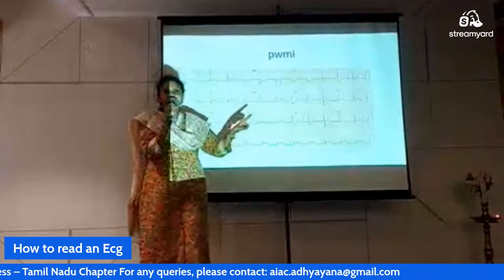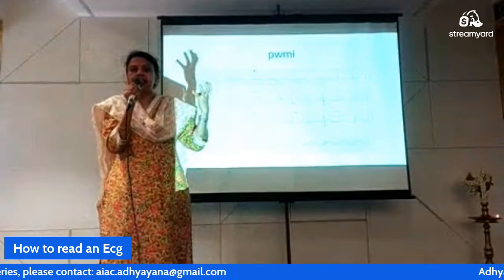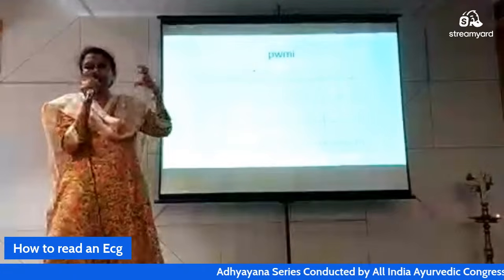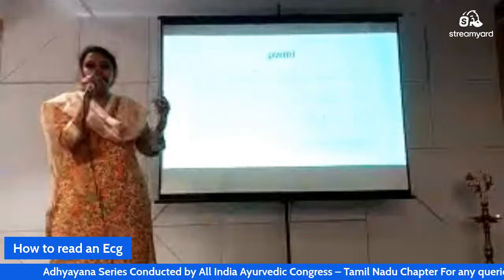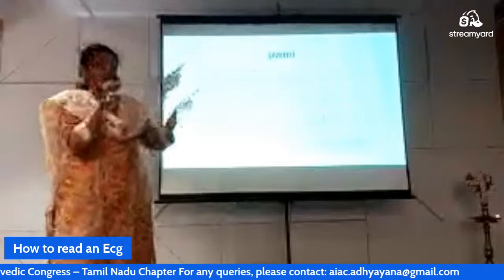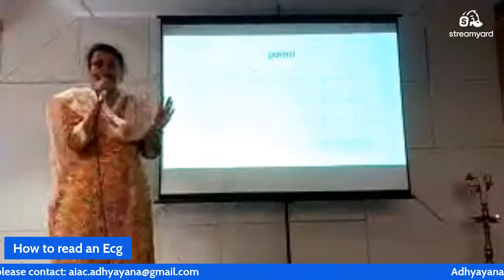These chest leads and limb leads are like taking a picture of a heart in 3D, from all angles. But you will not be able to take the picture of the heart from the back. So with posterior wall, when you take the ECG, you will not get ST elevation at all. So without ST elevation, you might think that the patient is not having MI, but you should not send the patient home. So this is the key.